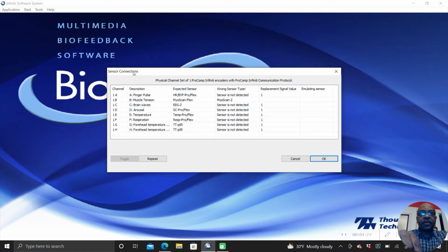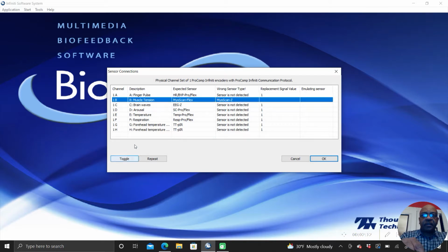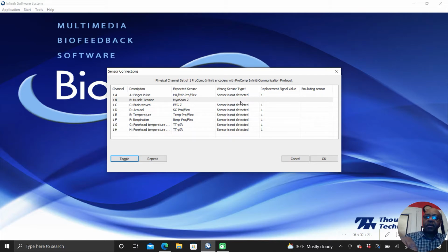Now, when we go to our sensor connection screen, I have this sensor plugged into B, but it is a MyoScan Z, and the screen is expecting a MyoScan Flex, and it's saying wrong sensor type. MyoScan Z is what's detected. So I'm going to click on that, and you see down here there's a toggle and repeat button. If I highlight this one, now this toggle button is active. So I click on toggle, and we're going to see this MyoScan Flex change to MyoScan Z. So now it's MyoScan Z, and the wrong sensor type column is now blank. That MyoScan Z that was there disappeared.